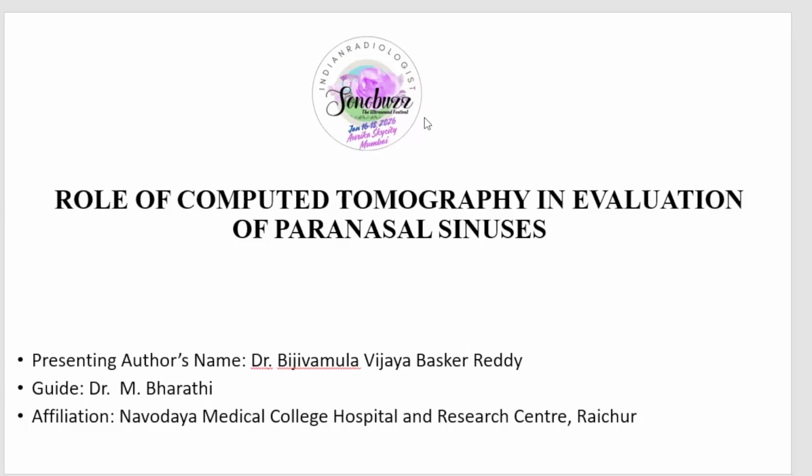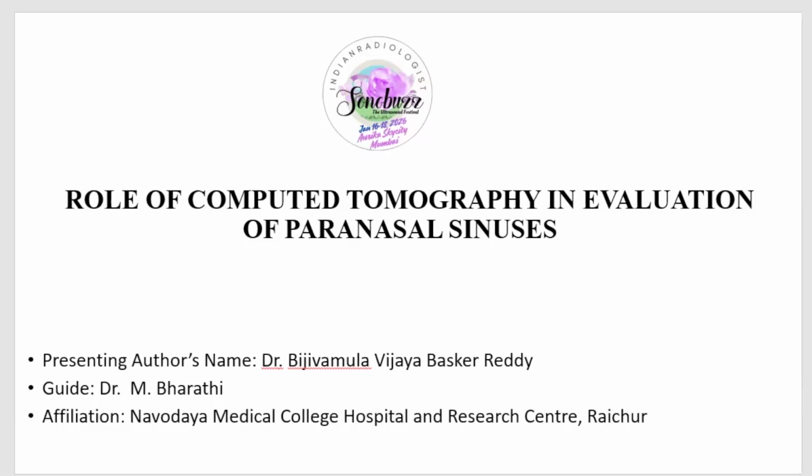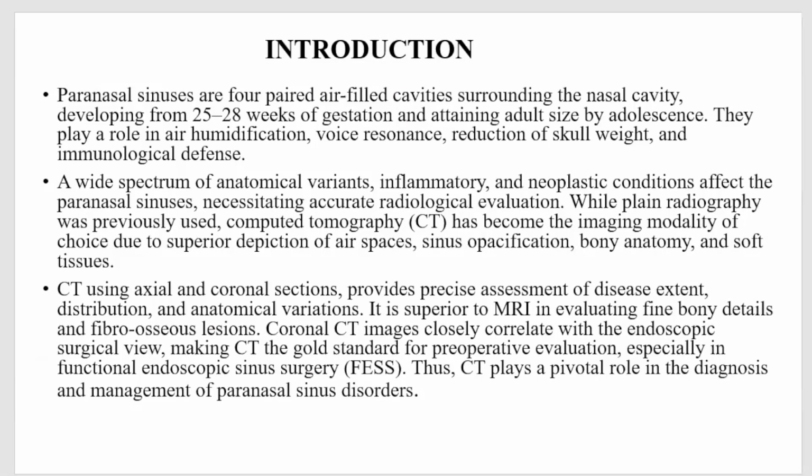I did my paper presentation on the role of computed tomography in evaluation of paranasal sinuses. First, paranasal sinuses are four paired air-filled cavities surrounding the nasal cavity, usually developing from 25 to 28 weeks of gestation and reaching adult size by adolescence. They play an important role in humidification, voice resonance, reduction of skull weight, and immunological defense. And CT is superior to MRI in evaluating bony details and fibro-osseous lesions.